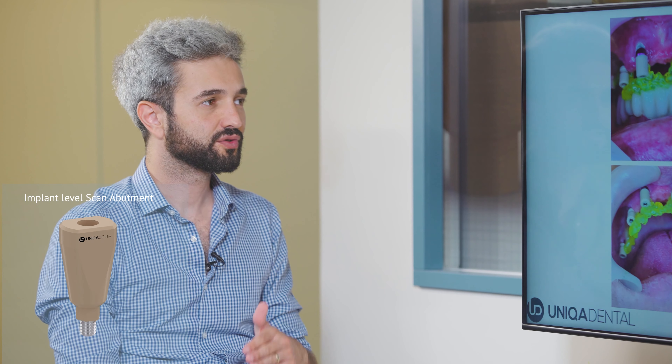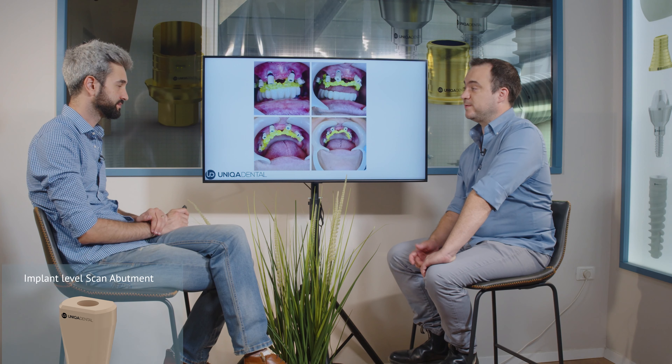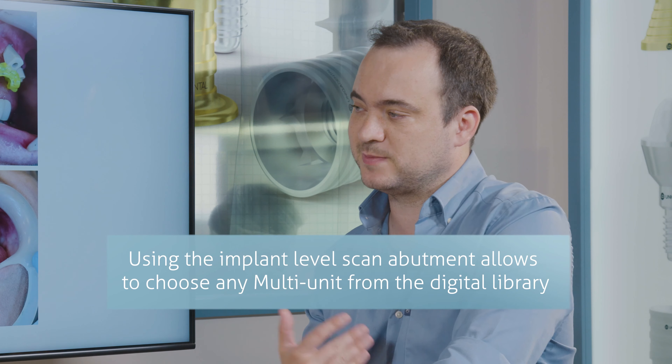Yes — straight, angulated, everything you want. Exactly. And when you choose a multi-unit level scan abutment, you need to choose the multi-unit that you want already before taking impressions, but the design process is much simpler. So we took both impressions at the same time.